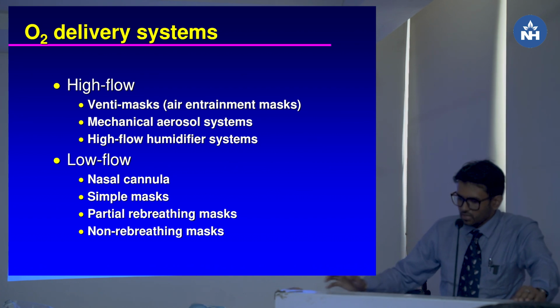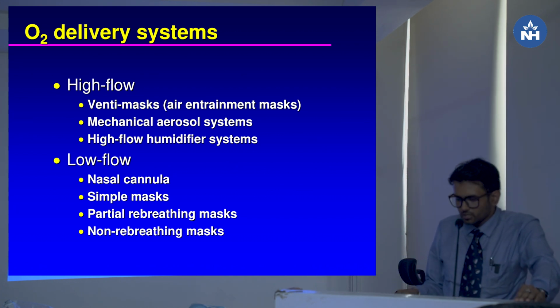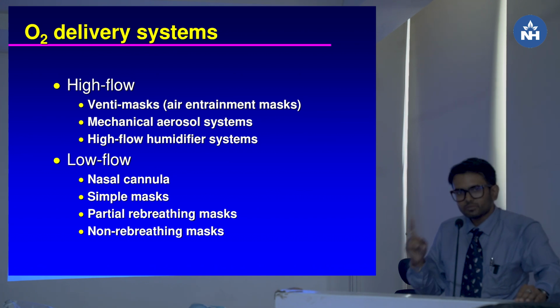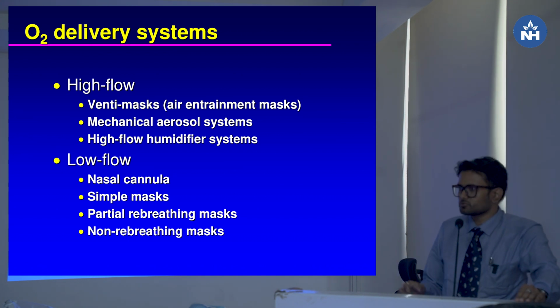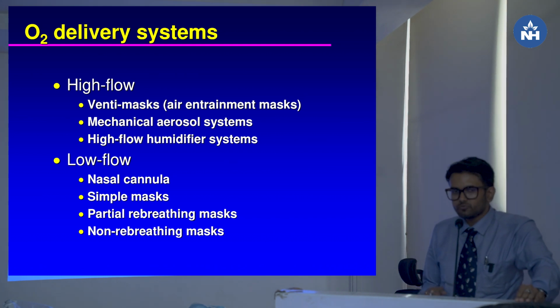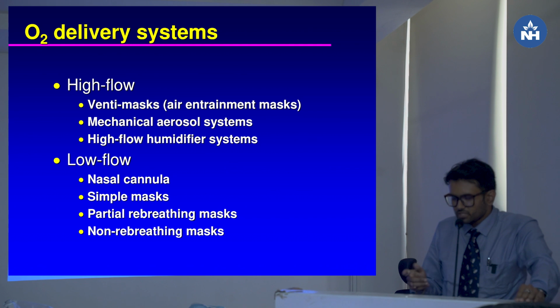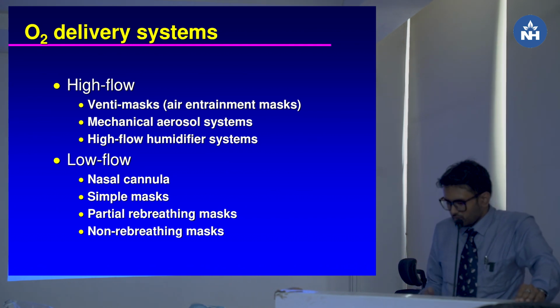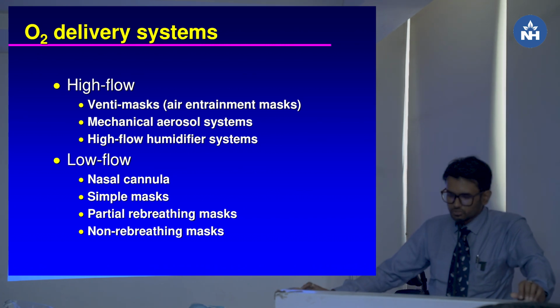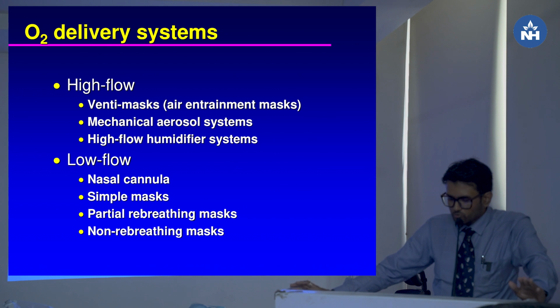But altogether, the basic target of this slide is how we can give oxygen to the patient. But not all patients require only oxygen. There are some patients who require a smaller amount of oxygen, mainly COPD patients. In that case we have to adjust and titrate the supportive instrument as per the clinical scenario. So this is mainly how we can give oxygen.